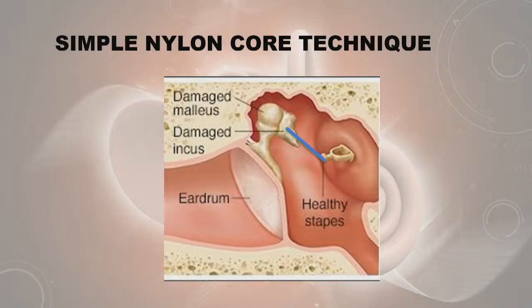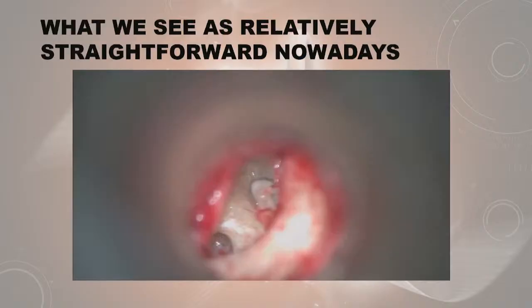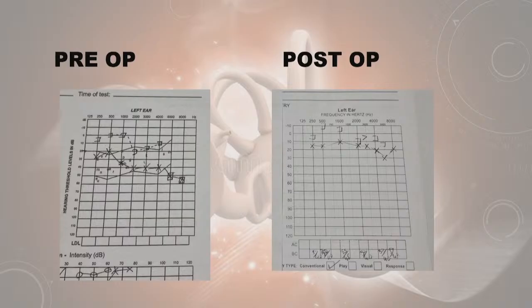That's a typical incudostapedial joint disassociation. You then put some cement on it, and there you go. And I thought what we'll do here is just show you what that looks like in real life.